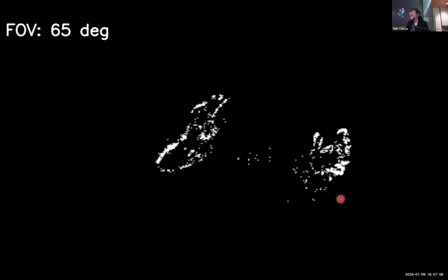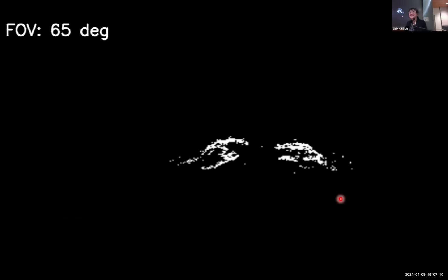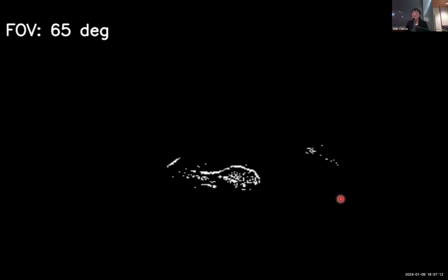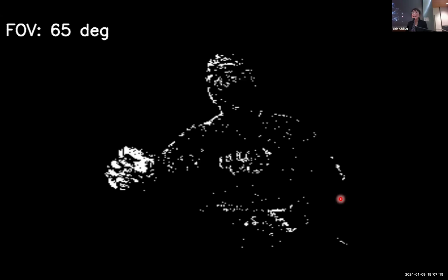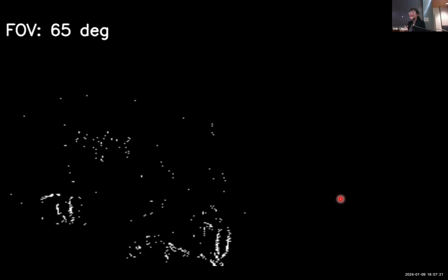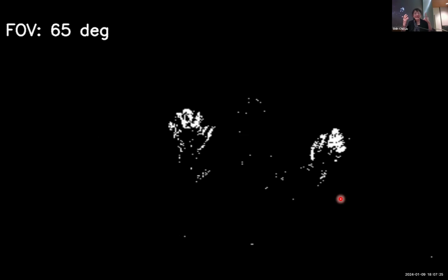And here is the actual DVS output. So that's easy, right? But the phosphene output is way more difficult. Anyway, I think it lets you appreciate what somebody who's getting one of these prostheses would be seeing.